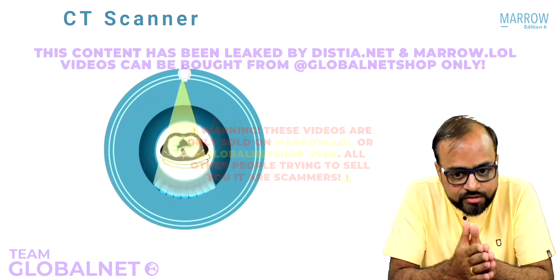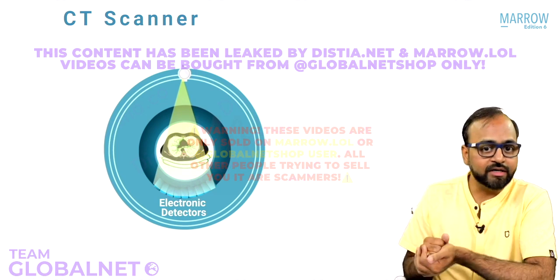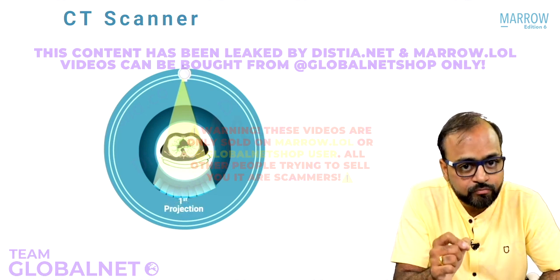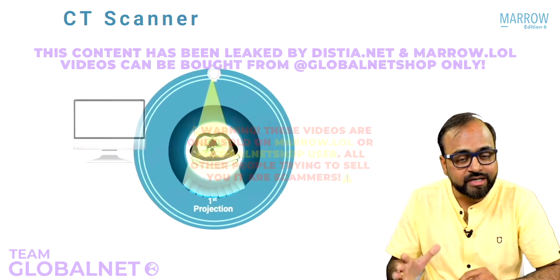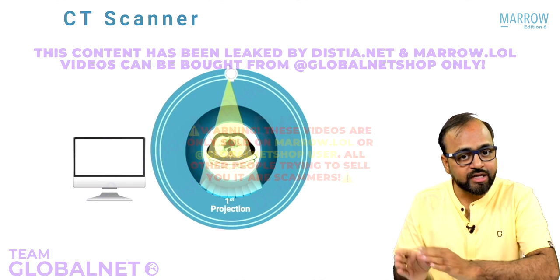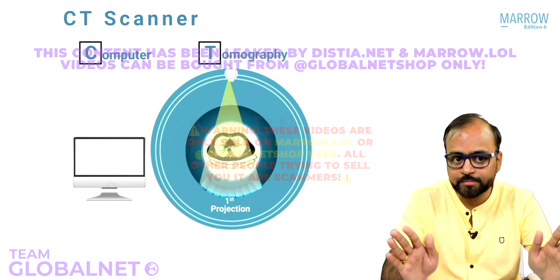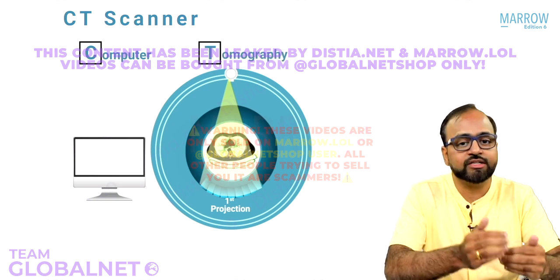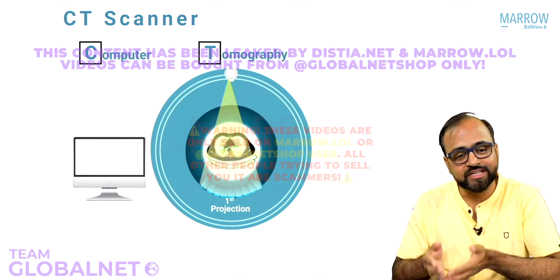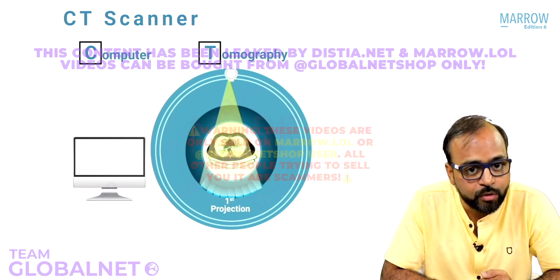But these detectors, remember, are electronic detectors. So the data that they have collected is given a name. It is called the first projection. This is electronic data. Now all this data which is collected by these detectors as the first projection is then transmitted to a computer. Do you remember two parts of the machine? One is computer, one is tomographic setup. That is what CT scan is. So this data is then transmitted to a computer. This is just like taking one X-ray projection or one spot radiograph that we have seen, isn't it? This is just one projection which has been obtained here.